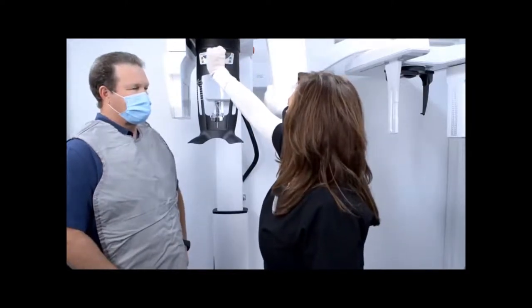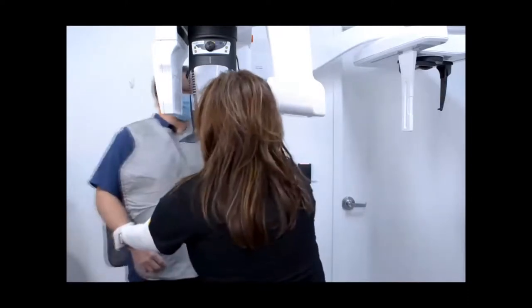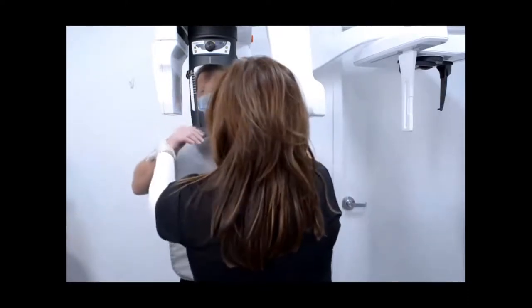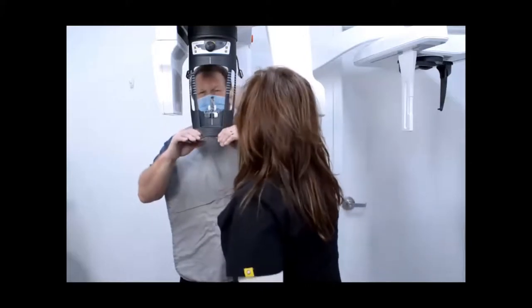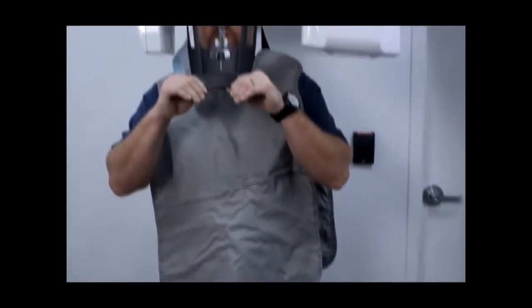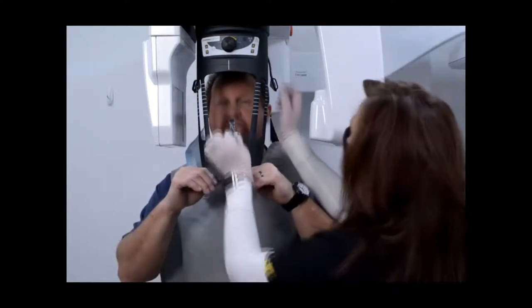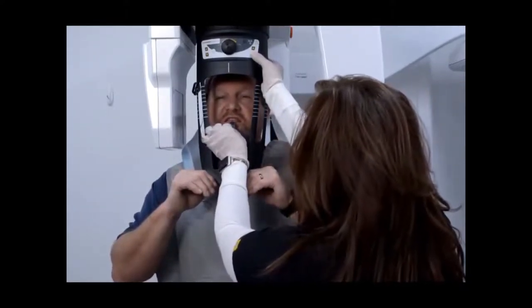Turn the temple support adjustment knob counterclockwise to open the temple support laterally. On the positioning panel, press and hold the height button to move the machine to the height of the patient. If the patient is tall, have the patient sit on a stool and then adjust the unit. Ask the patient to stand up straight with feet at shoulder width. Ask the patient to bite on the bite groove. Have the patient part their lips and verify that the teeth are in the bite groove.